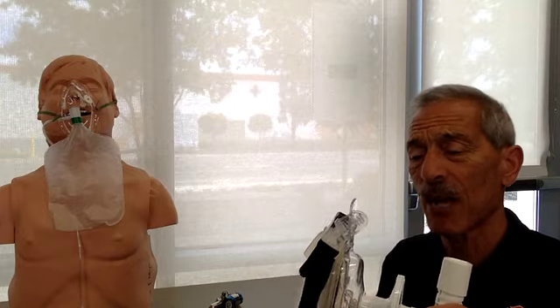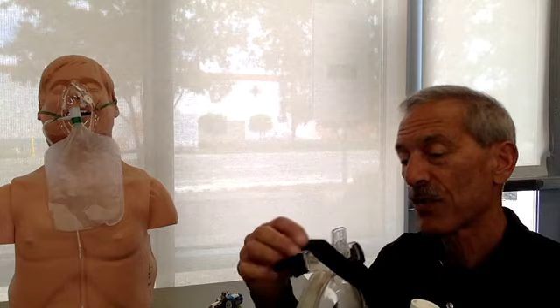So now that I have this thing assembled, my patient's still awake and alert and talking to me. His saturation is still pretty low, so I want to apply this to the patient. I always ask my patients, and they can nod yes or no: have you ever had CPAP before? And they say yes. Have you tolerated it? And they say yes. That's great. If they say no, I want to coach them through this process. Explain what this is, how it works, and that it's going to push air into their lungs to help them breathe better.